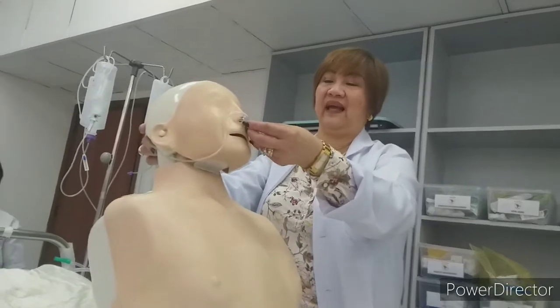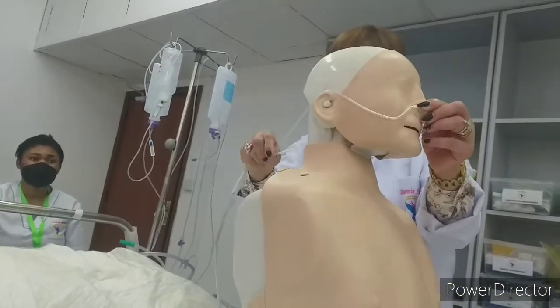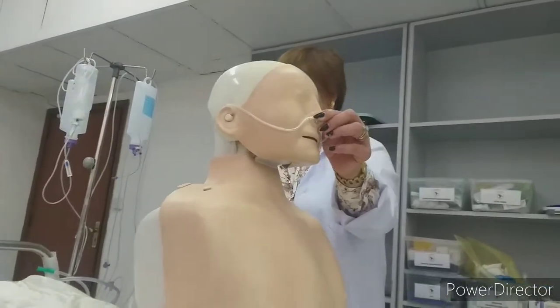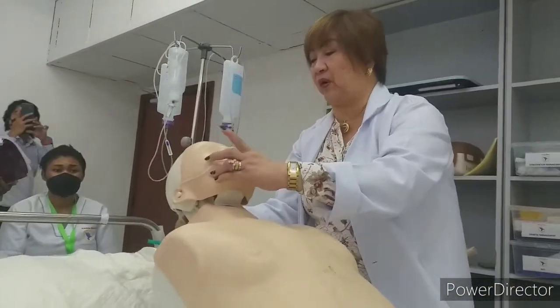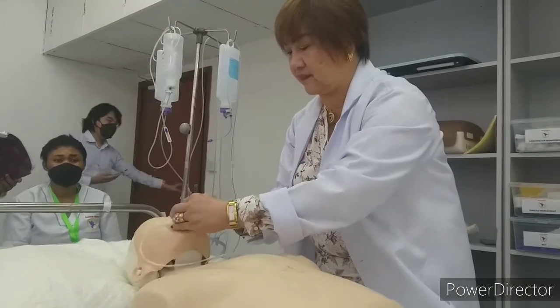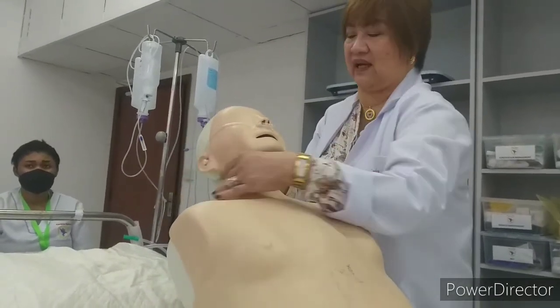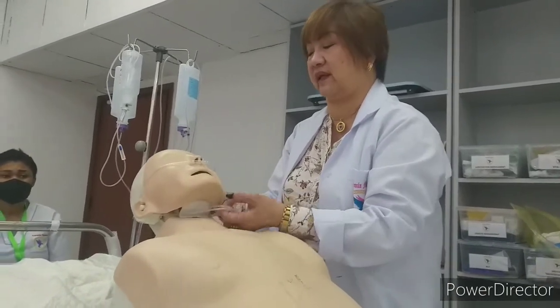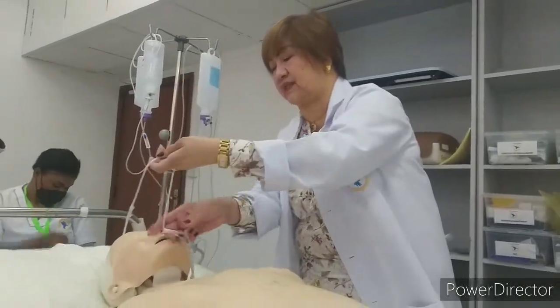Okay, that's one thing. And this thing, you are going to adjust it over the ear and adjust at the back of the head. So it's not going to touch the nape or even this one. There are some people who are using this in front, around the ears underneath the front. Okay? So, as you said, there is a possibility of choking because it is in the throat. Okay? So, better use it at the back. So, more safer if you are going to use it at the back.